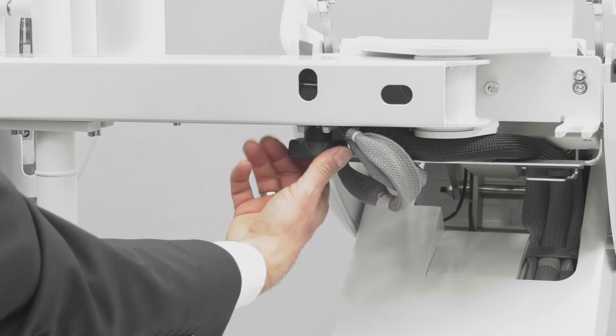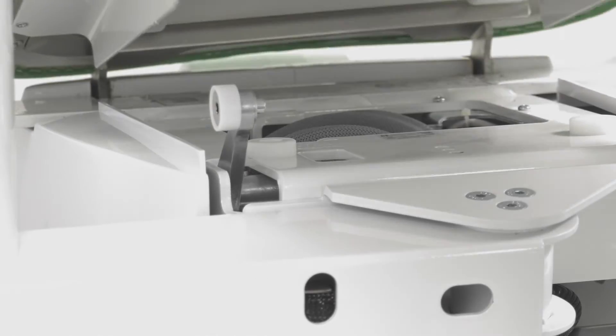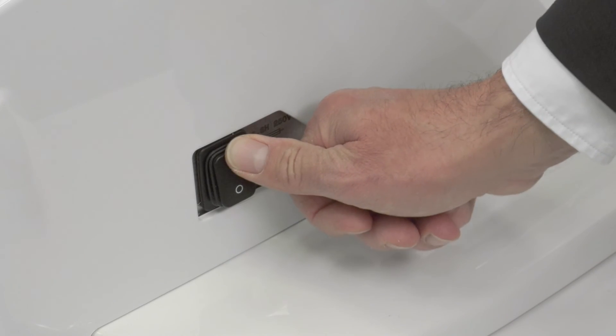Fully tighten the screw once again. Secure the bench. And turn the unit back on.